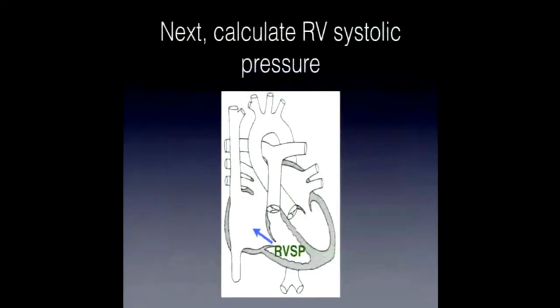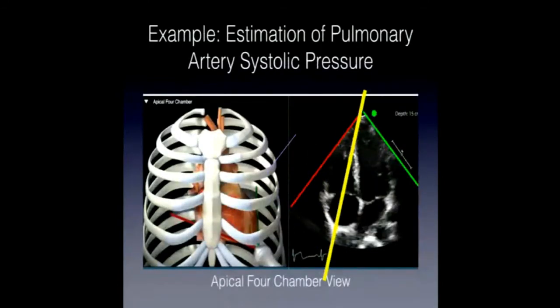Oh yes, this is just trying to represent the whole heart. This is actually very darn good because you'd be surprised what we tolerate in TEE for now. The aortic valve we line up well, so that's one we often operate on, so that's good.